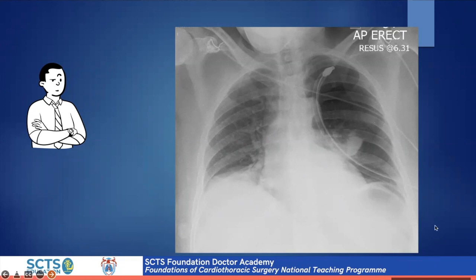In the same triangle, does it look like it is in the same triangle? The triangle at the top? No, the way the drain is inserted. It's quite low, isn't it? I don't know. It definitely is quite low insertion on the area of the chest cavity. Yeah, it's almost at the level of the diaphragm here. But essentially, when we look at the chest drain tubing, is there anything strange about it? Is the drain inserted the other way round?